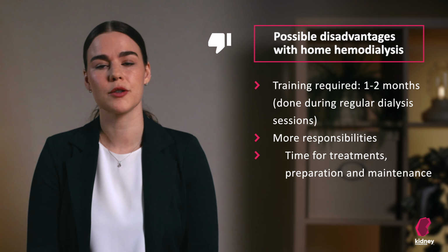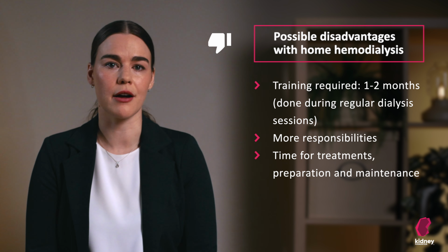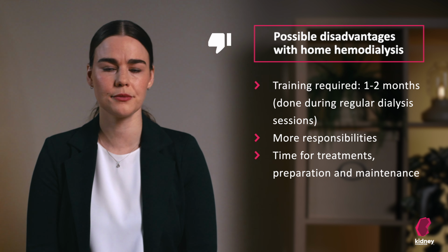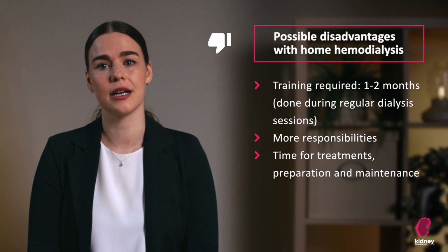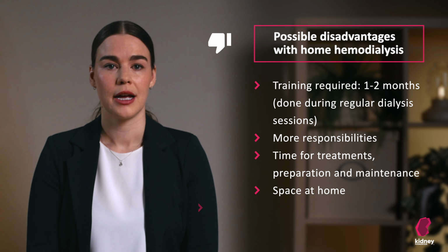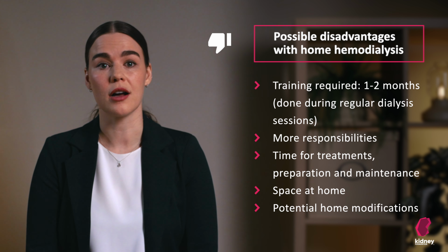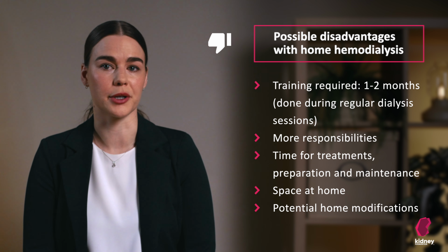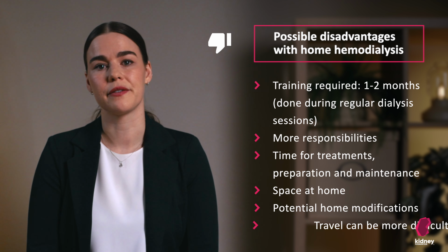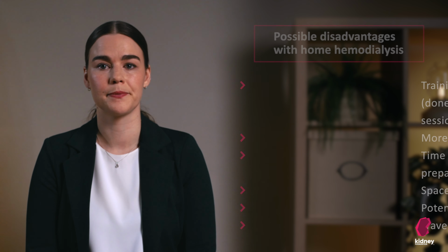Home hemodialysis requires time for the treatments, but also for preparation and maintenance of the dialysis equipment. The hemodialysis machine and water filtering systems take up space in your home. It may require some home modifications, such as plumbing. Costs for the home modifications are reimbursed. It is more difficult to travel on vacation than with peritoneal dialysis.